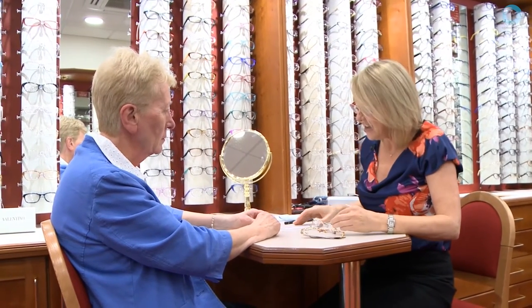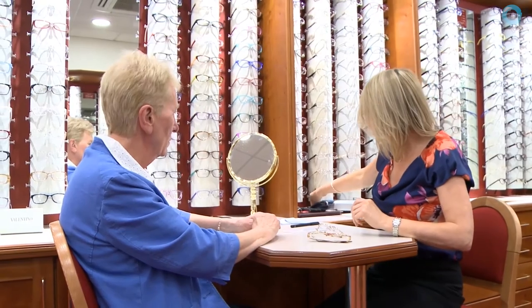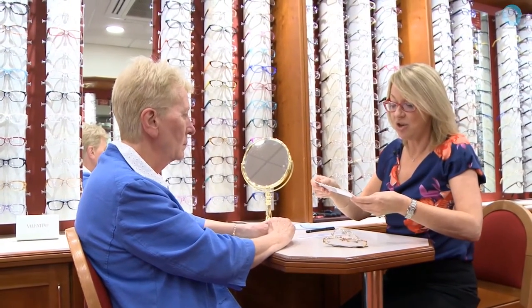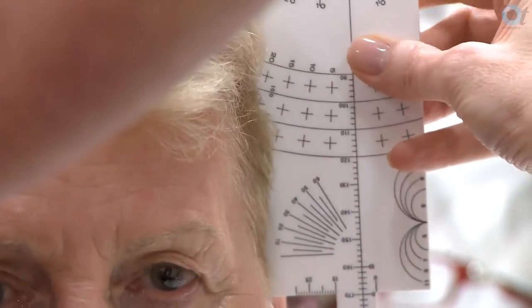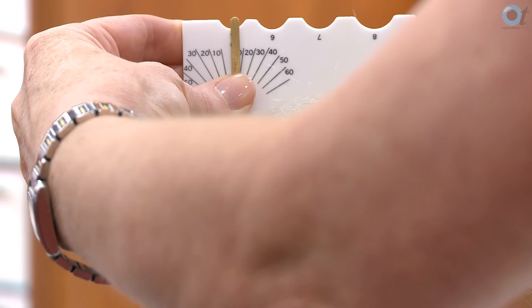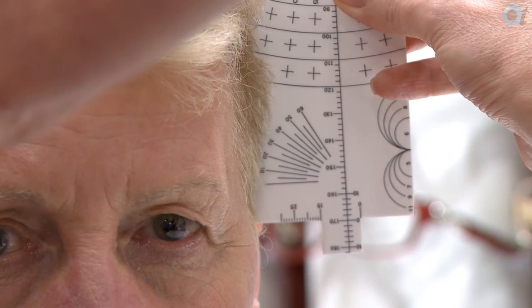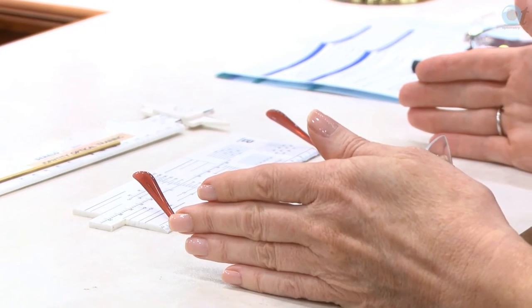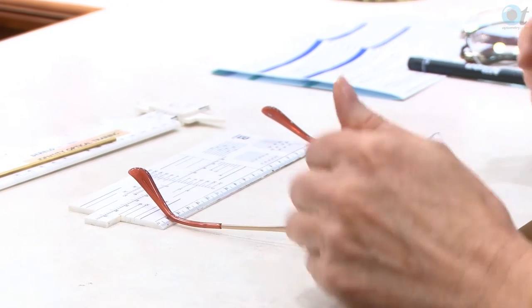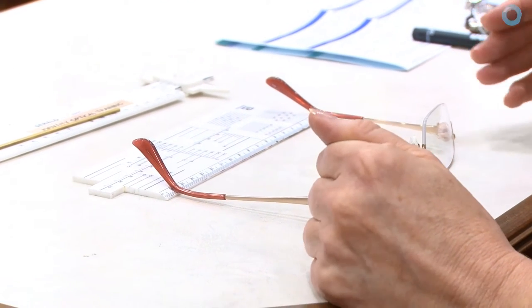The final measurement I take is the head width. If you haven't got head width calipers at work, you can always use a facial rule and a frame rule. We measure ear point to ear point, and Judith measures 145 millimetres. When setting up the frame I'd compensate the head width for a close fitting, so I would reduce the head width by 10 millimetres. This is ideal for patients who wear turbans, head scarves, or a wig so that the spectacles fit close. I want to adjust the let back on each side to make the head width 135, compensated to fit the patient.